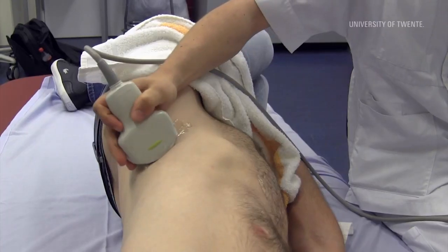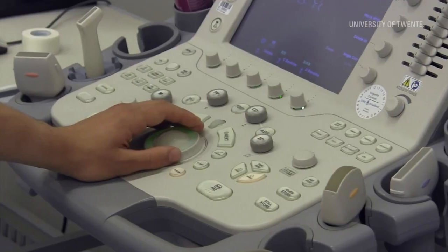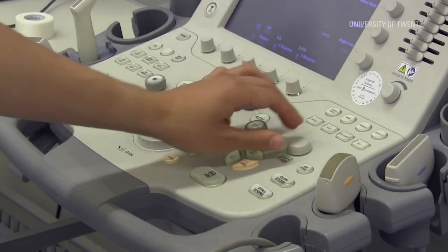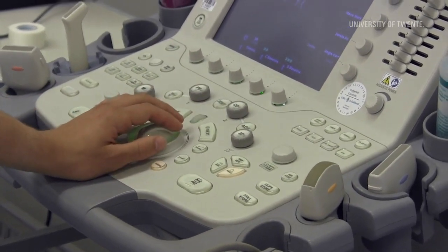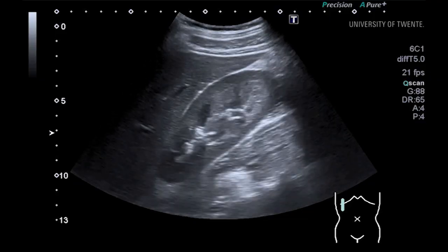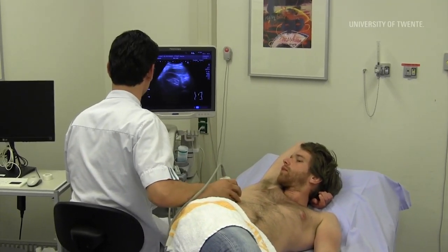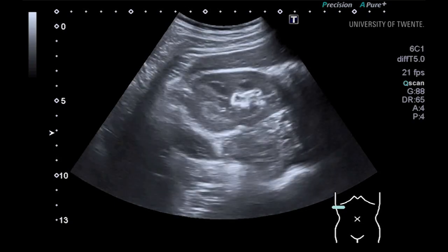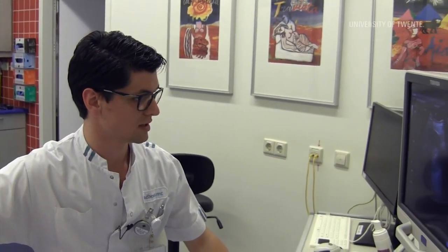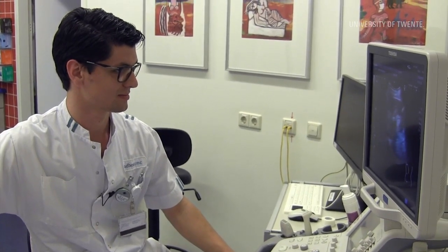Of all these accessible organs, you may have seen that it is important to have the suitable transducer, to let ultrasound reach all the important deep structures. Imaging parameters should be adapted to optimize imaging for each individual organ or even a part of an organ. Furthermore, the abdominal organs are of course three-dimensional, whereas our ultrasound is only transmitted in 2 dimensions, making a 2D image. A proper visual spatial perception of 2D and 3D surfaces is therefore essential for interpretation of the ultrasound images.